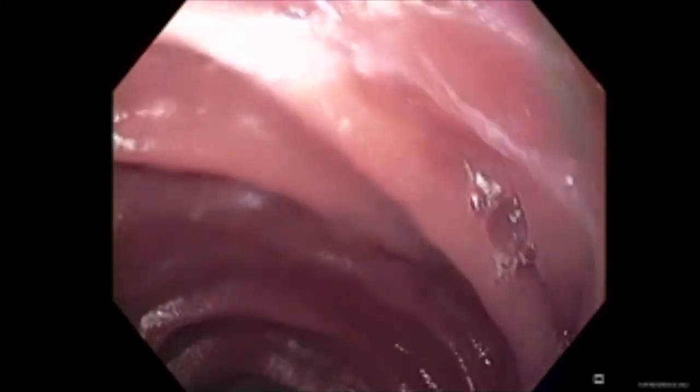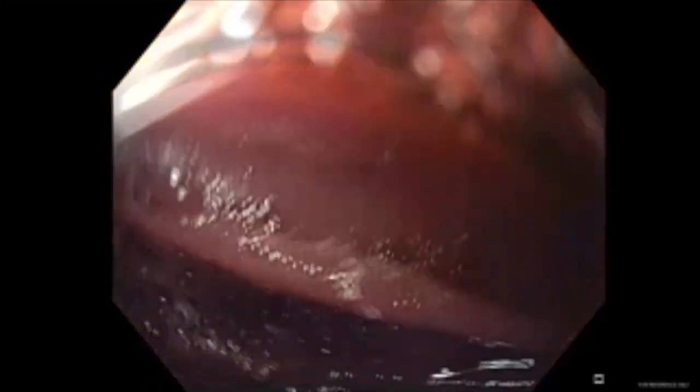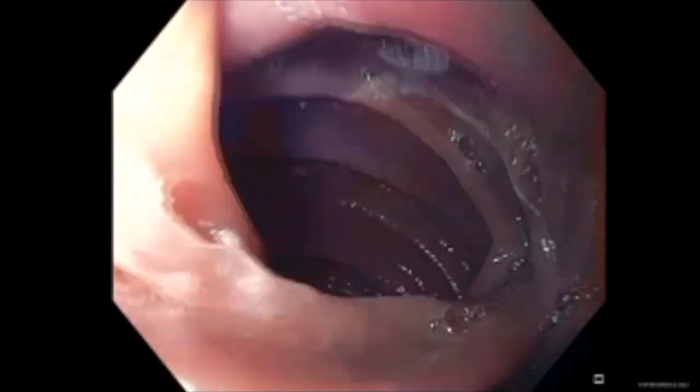The blind limb of jejunum may be measured and examined, and note that a long blind limb may develop ischemia at the tip, leading to abdominal pain. This is also known as the candy cane Roux syndrome, which generally requires surgical blind limb resection. We also routinely examine the Roux limb as far as the gastroscope will allow.